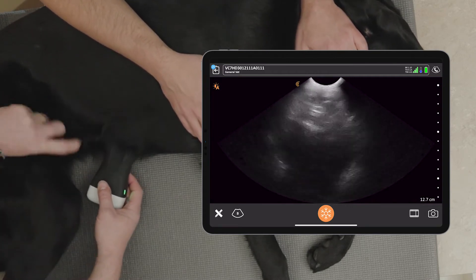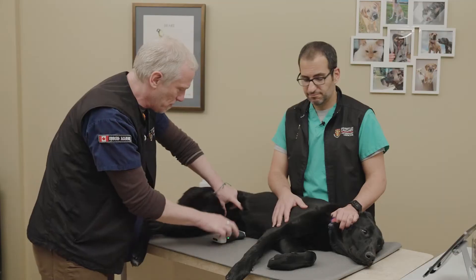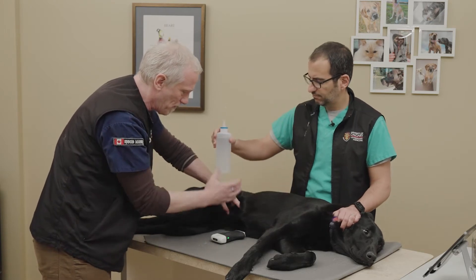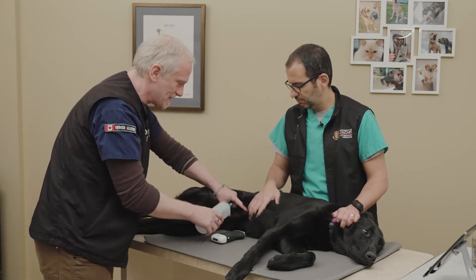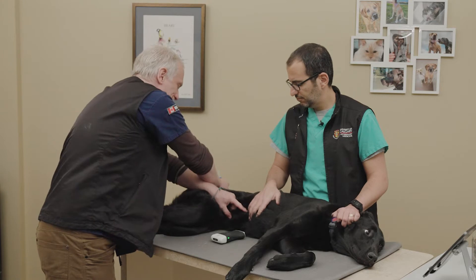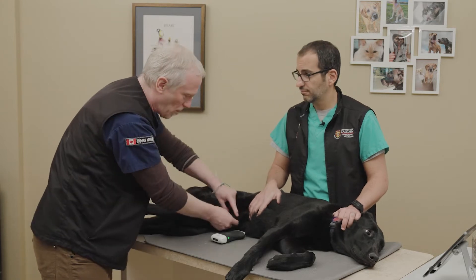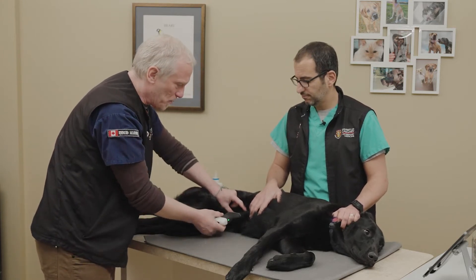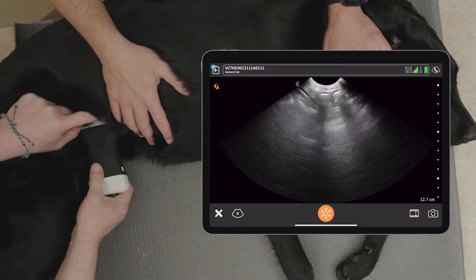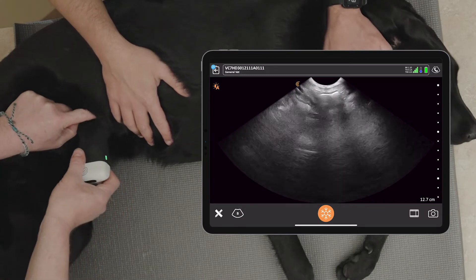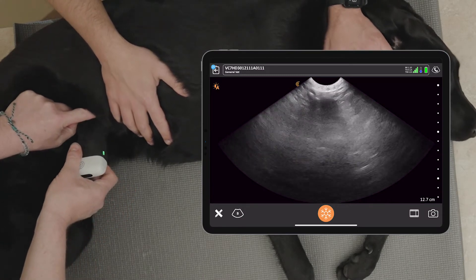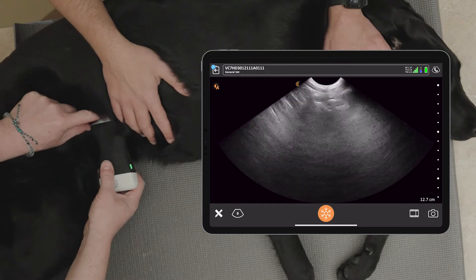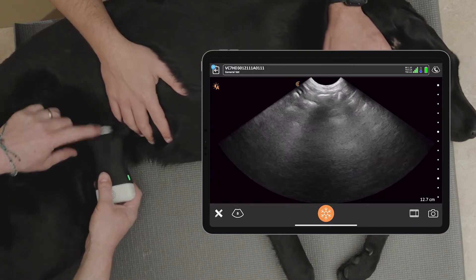Following the sub-xiphoid site, we come back and do the umbilical site. We separate the fur, apply alcohol, essentially at that site where we'd get a scar if we were doing an ovariohysterectomy. We put the probe on at that umbilical site and angle the probe down if we're looking for fluid, but we can also look for other structures like the spleen — we'll go through that in more detail.